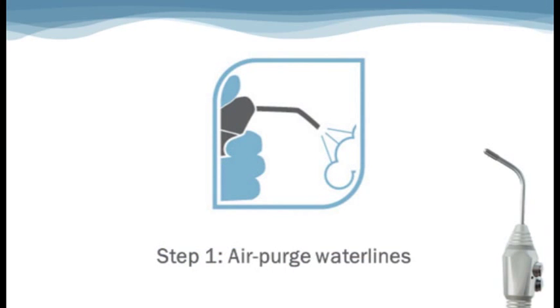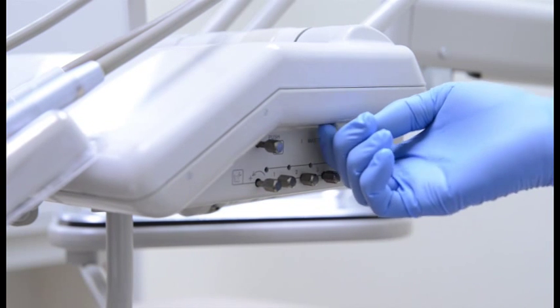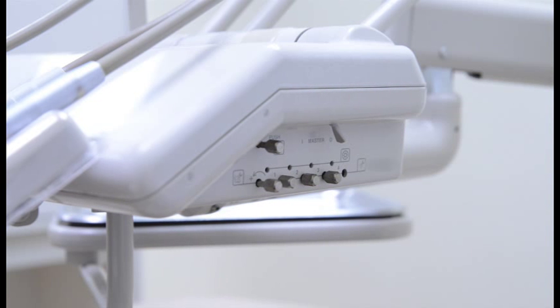Now we are ready to begin with step one, Air Purge Dental Unit Waterlines. To air purge, turn the dental unit off so it releases the pressure in the bottle. You can do this by using the master control, which is usually on the side of your dental unit.